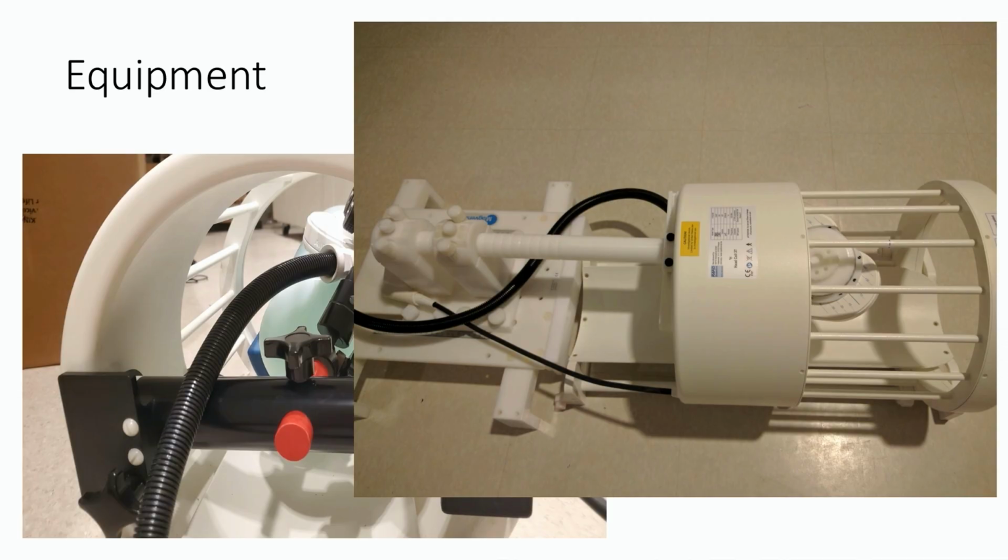For example, if you want to lock down one brain region and keep it there for your entire scan session, it's pretty robust, it's pretty solid. It lays in the bed of the scanner, it moves in and out. It has all these articulating joints, and it ratchets down, and it holds pretty nicely, and there's enough flex in it that if it flexes the kind of scalp muscle and it moves it, it'll snap back into place pretty nicely, which is important because you don't want the motion contaminating your fMRI signal.